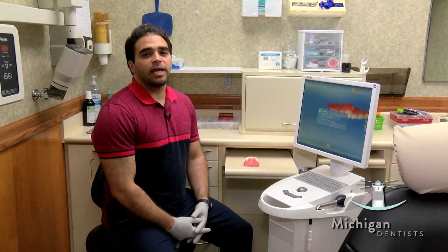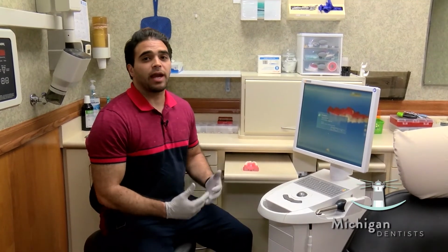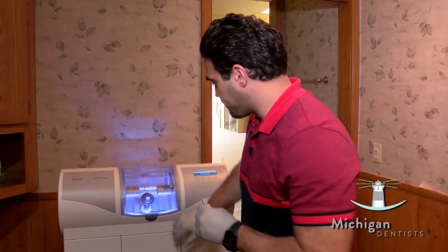So now we finished designing the crown on the computer. We're gonna send it out to the mill. The mill is going to create that crown for us out of a solid piece of porcelain. Let's check that out. Okay everybody, this is the block that we've chosen with the custom shade. We're gonna load this into the mill and it's going to make our crown for us. Away we go.